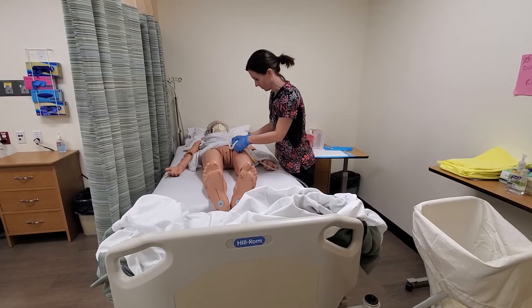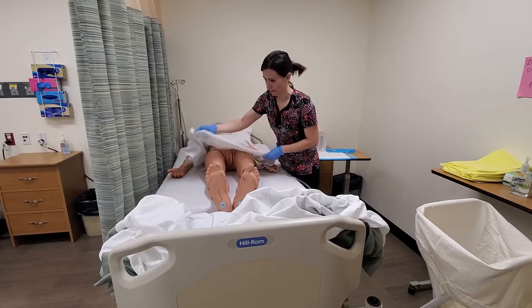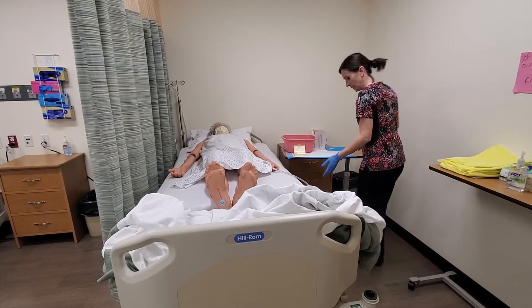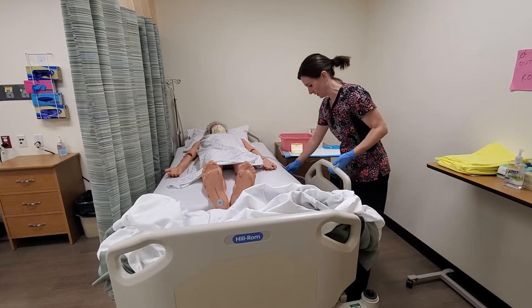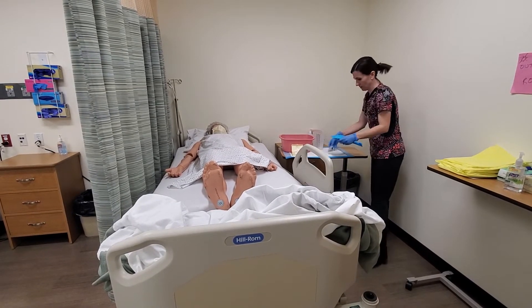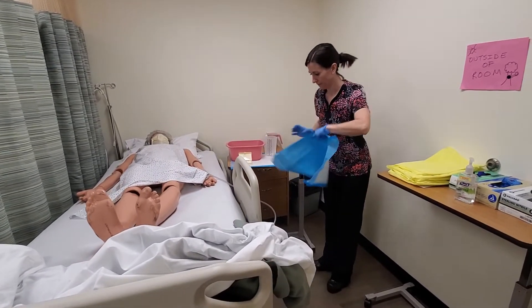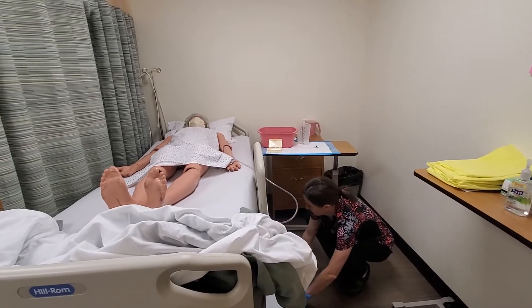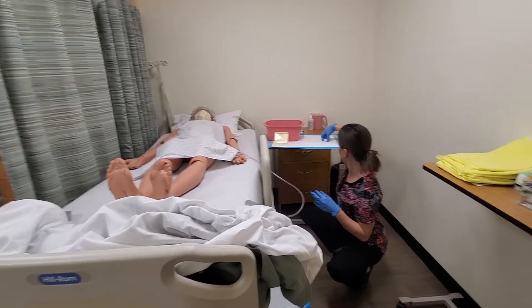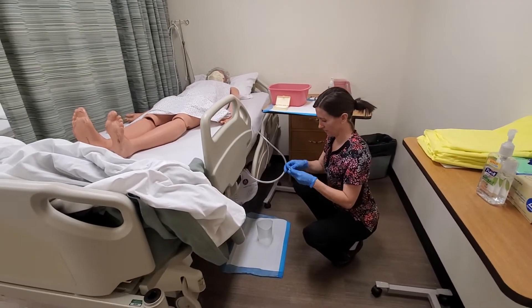Still making sure that there are no restrictions, I'm going to go ahead and cover the resident for privacy. I'll get my graduated cylinder and make sure I have my alcohol wipe open and ready.